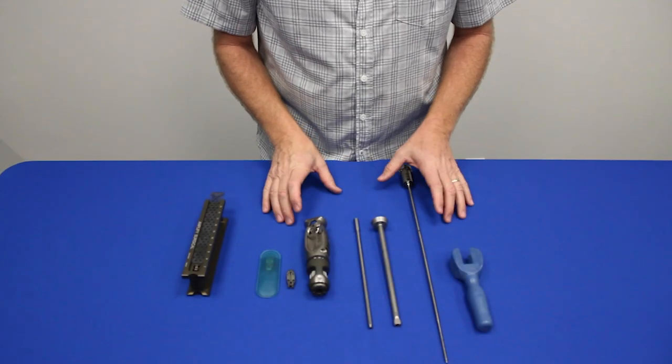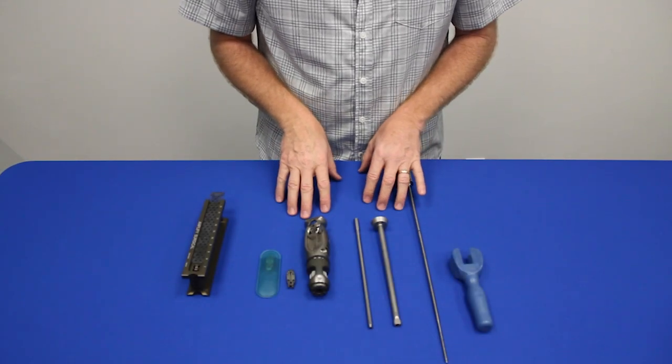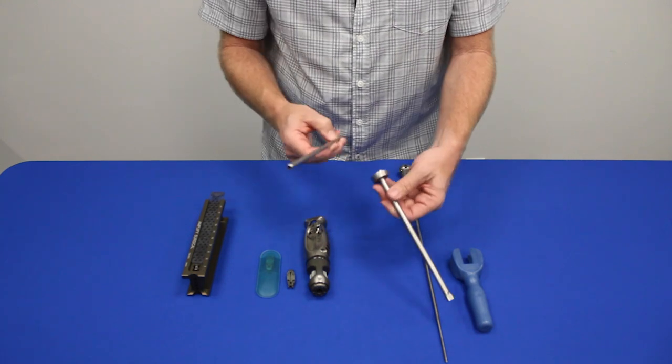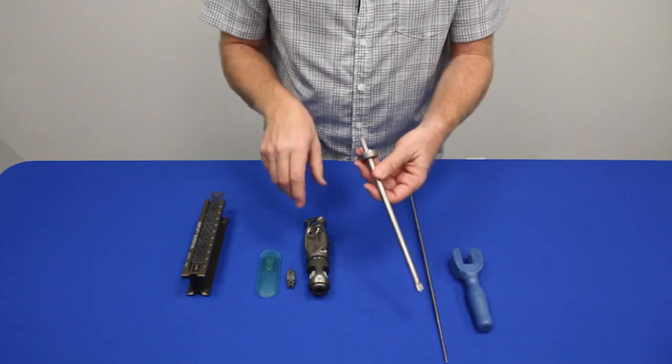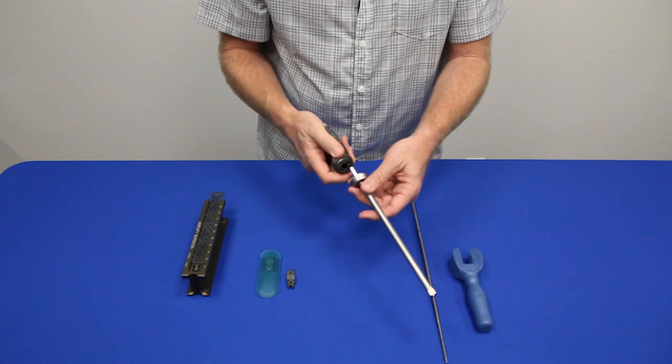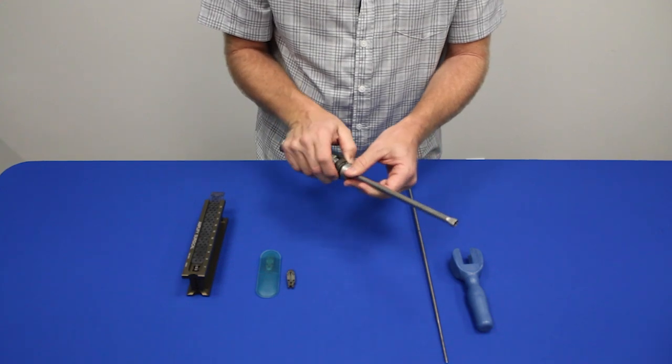So now let's go over loading the X-Handle with the implant. The first step is to put the inner tube into the outer tube and then load it onto the X-Handle itself with the click of the tabs.